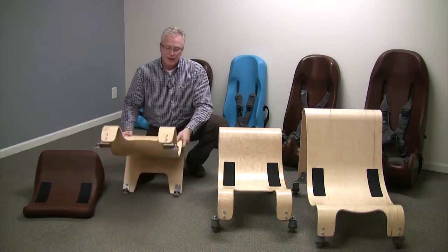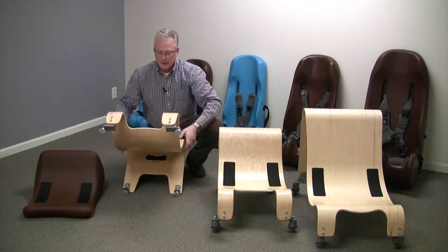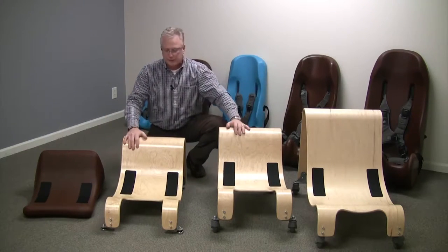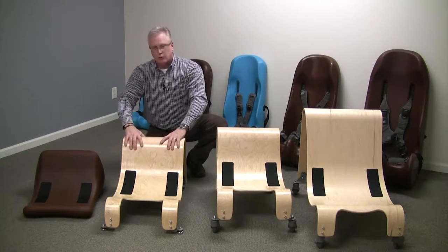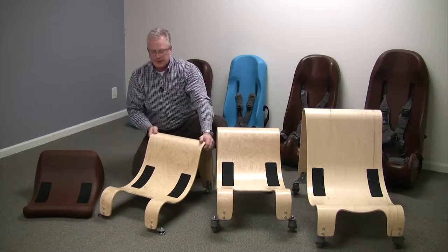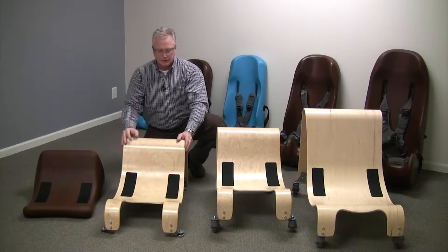The stationary base does have these furniture glides on the bottom, and all of these bases that you see right here — the three wooden bases — are made out of a bent maple and birch wood, so they're really strong, they're beautifully made, and they really take the rehabilitative look out of the base for the sitters.